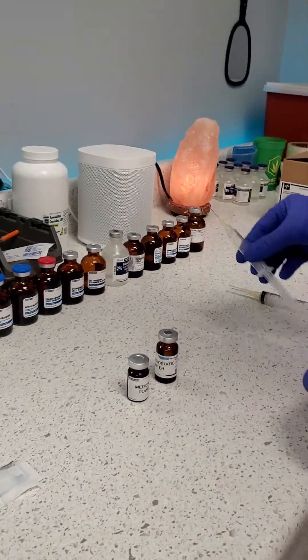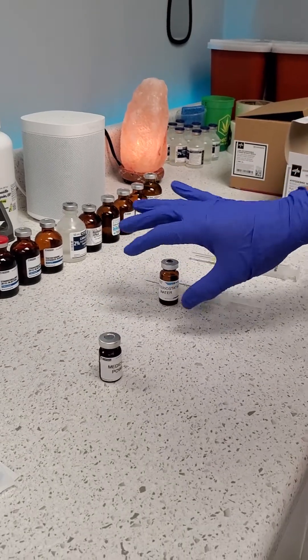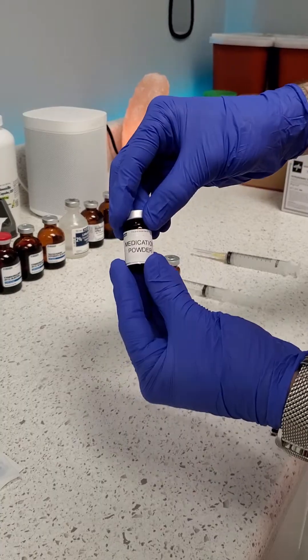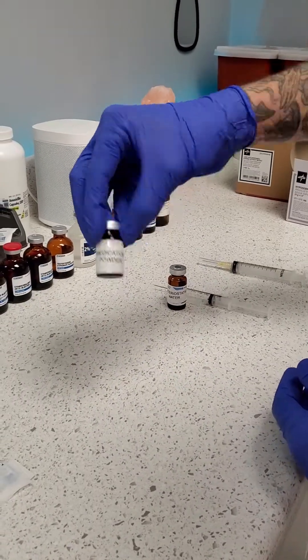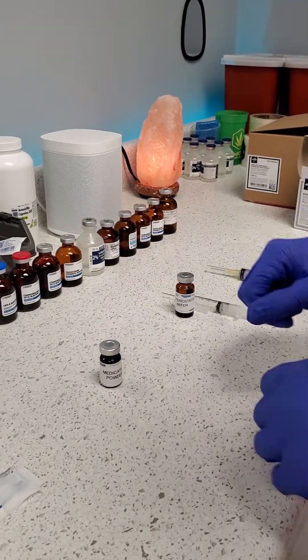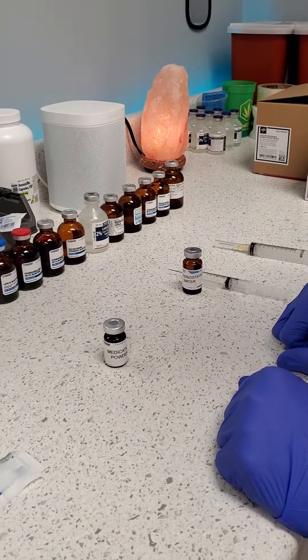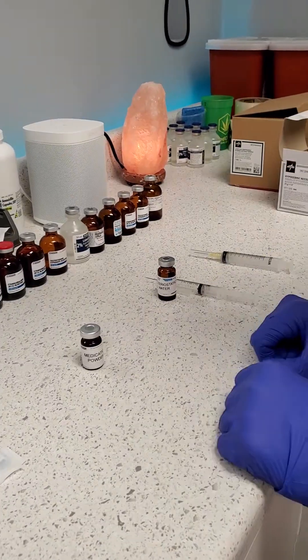Now dispose of your needle and the bacteriostatic water vial since that part is done. You now have 5 milliliters of bacteriostatic water mixed into your powdered medication. Give it a slight, very gentle mix and your medication is ready for use. Please follow the storage instructions, as some of these medications need to be refrigerated after they have been reconstituted. That's it — thank you.